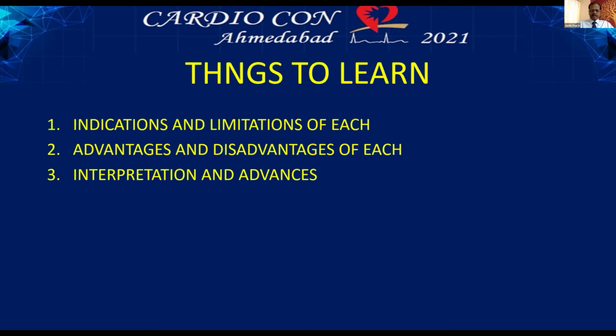So all of us are really now confused as to what to use at this point, IVUS or OCT. So Dr. Chirag, let me ask you, if he can manage everything with saline in OCT without contrast, he can safely manage a CKD patient, and he can also see a 4.5 millimeter left main. So with this take home, what will be your comment on this?